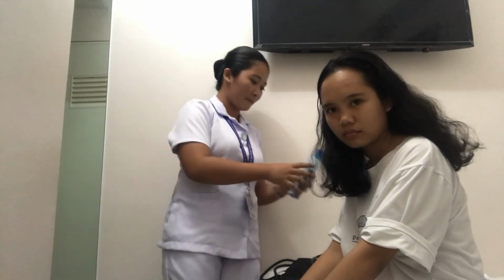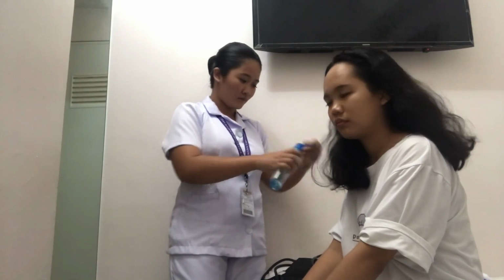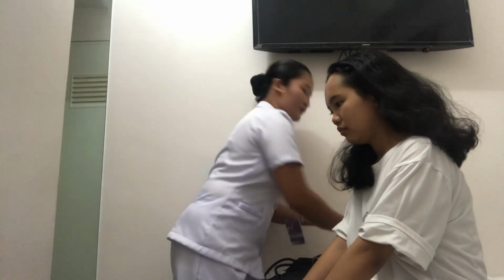So now I'm going to take the patient's body temperature through her axillary site. Prior to conducting this procedure, I need to do the first introductory steps, which are to ensure my patient's privacy, provide comfort, and do hand hygiene. Then, I will introduce myself to the patient and explain what procedure I'm going to do.